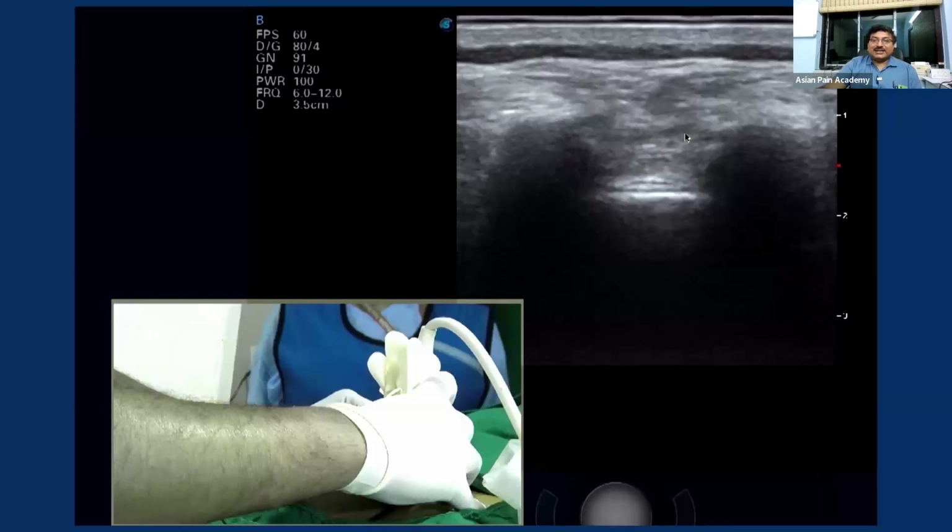So here is the area that I have shown. Here we are seeing the cross-sectional view over the sacral hiatus. As I told, this is the left-sided corner, this is the right-sided corner, and this portion is the posterior part of the body of the S4 and S5 vertebral body. And we can see another hyperechoic line at this point. Okay, so I am deleting it so that you can see. There is a hyperechoic line, and this line represents the sacrococcygeal ligament, which is covering this area.